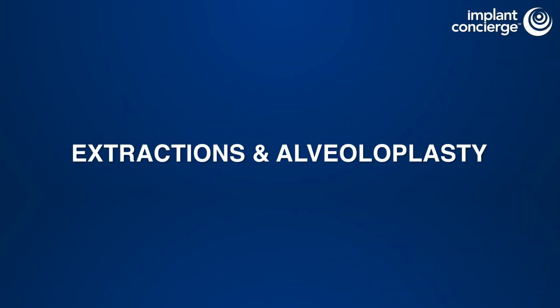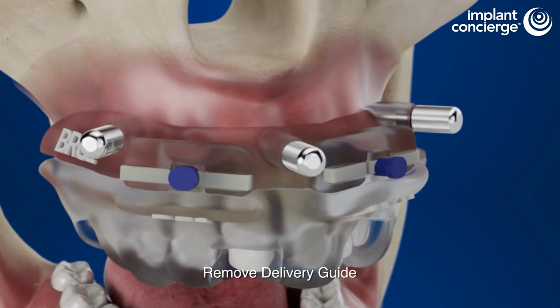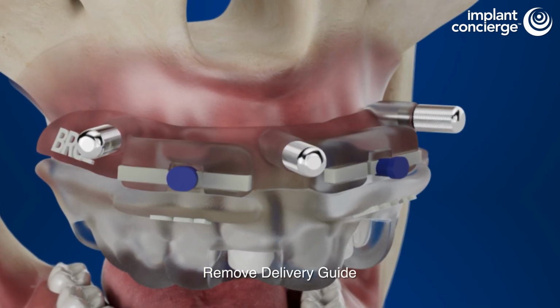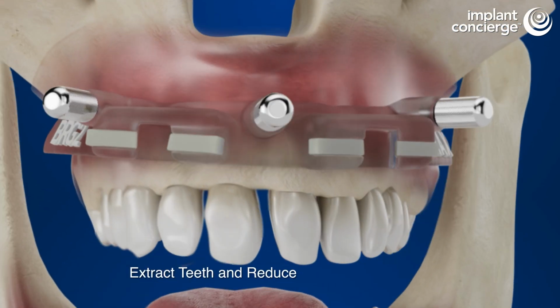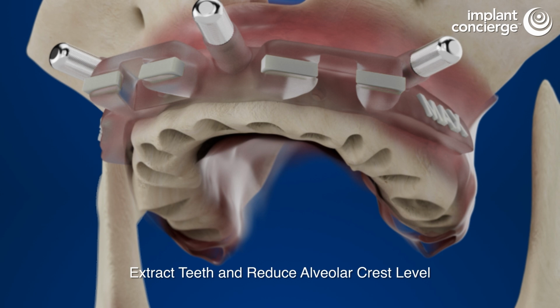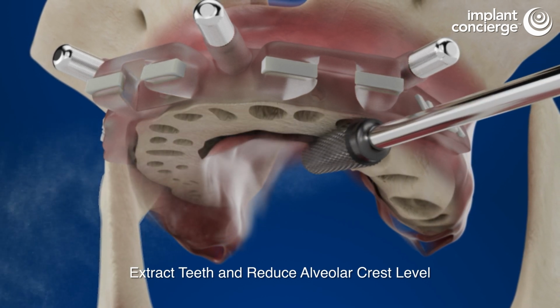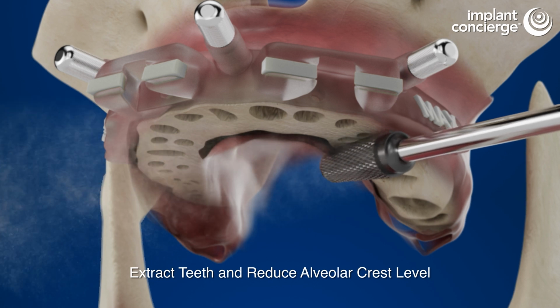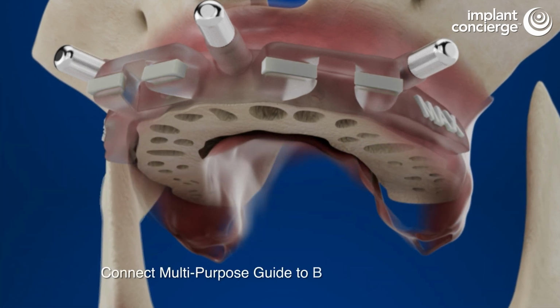Now, moving on to extractions and alveoloplasty. Carefully detach the delivery guide from the bone reduction guide by removing the blue pins. Follow the surgical protocol for tooth extraction. Ensure the bone reduction guide is not used as a leverage bar. Reduce the alveolar crest level with the contour of the bone reduction guide, minimizing contact with the guide itself.